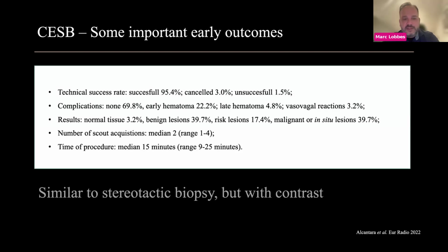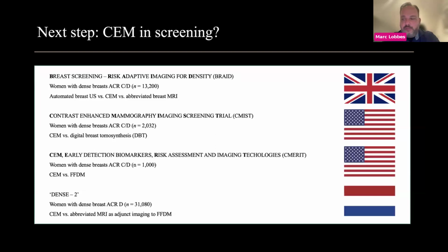So again, it's similar to a stereotactic biopsy, but with contrast. Now, the promising thing is that the results of contrast-enhanced mammography are so promising that in the early years, we were actually not talking about doing contrast-enhanced mammography in screening. Everybody was afraid about the increased radiation dose and the use of iodinated contrast agents. So everybody said, well, it's a nice tool, but we're never going to do this for screening because it takes too much time, too much effort. It's too dangerous on a large scale.